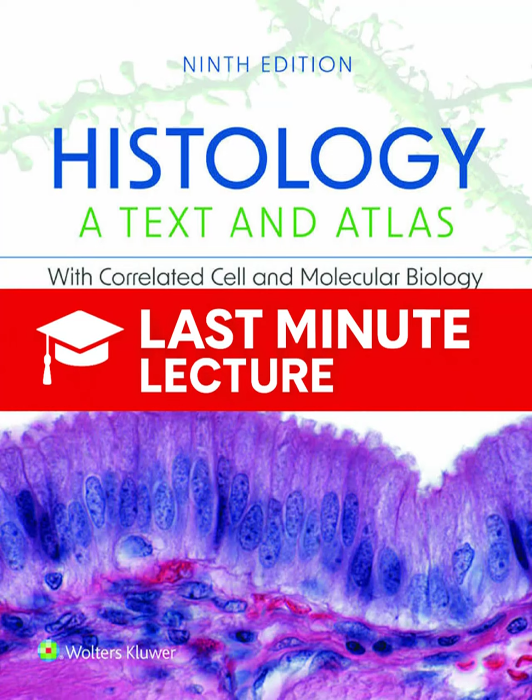And that's why the indirect immunofluorescence method, the sandwich technique, is so much more common. The indirect method is vastly superior because it gives you this dramatic signal amplification. You use an unlabeled primary antibody first that binds to your antigen. Then you add a second fluorescently labeled secondary antibody. And that secondary antibody is designed to bind to the primary one. Exactly. It's an anti-antibody. So if your primary was made in a mouse, you'd use a goat anti-mouse secondary. And since multiple secondary antibodies can bind to a single primary antibody, the fluorescent signal gets amplified considerably. You get much brighter, clearer images.